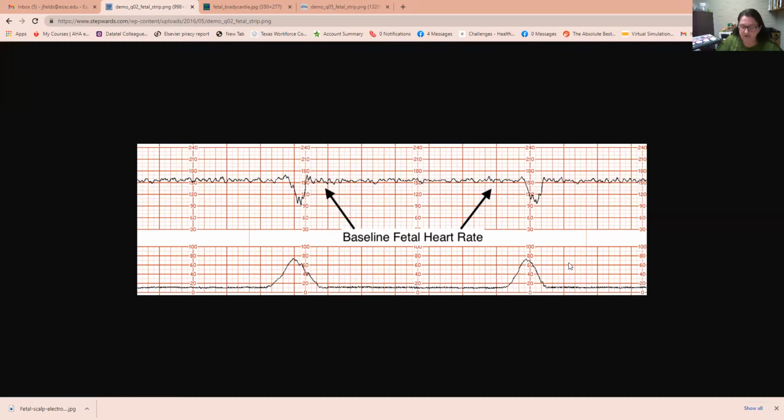So one way to measure adequate contractions is Montevideo units. Montevideo units are the difference in peak uterine pressure and resting baseline for every contraction in a 10-minute period. So this is, I think, 10 minutes. If not, it's close. We would do a 10-minute strip.